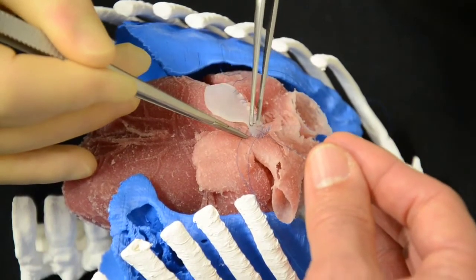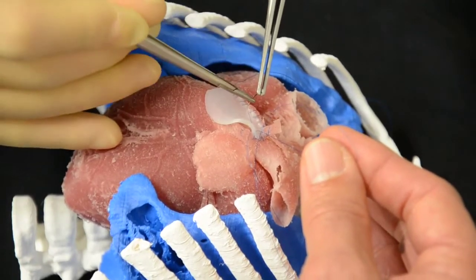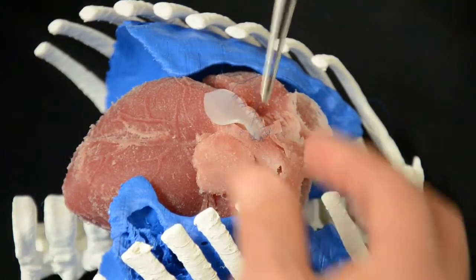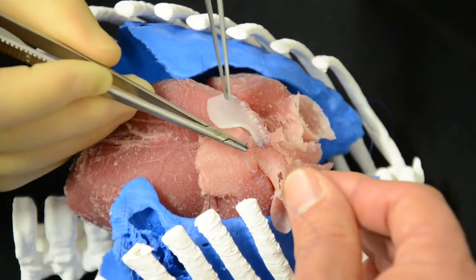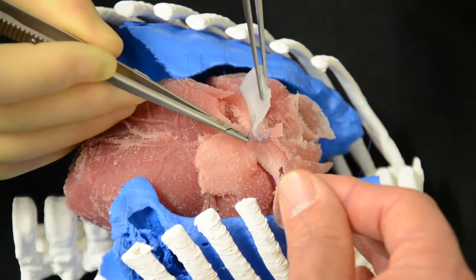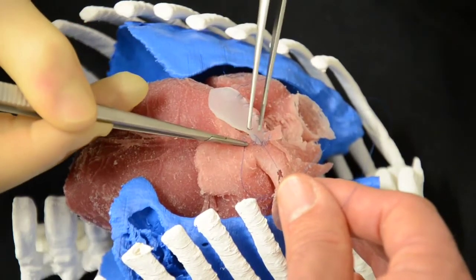I'm trying to twist the needle holder in my right hand in the way that the needle does the curvature, passing the needle through the tissue without tearing it. This is a very good material to train with for simulating the tissue of a small baby.